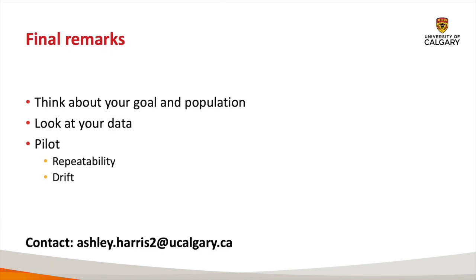So with that, I'll make a couple final remarks and recommendations. When designing your GABA study, always think about really what your goal is and what your population is and what makes the most sense. Always look at your data. It's always useful to know what your data actually looks like and what your quality is. Are you able to resolve that GABA peak? What artifacts are there? What contamination is there? And then I can't recommend enough piloting prior to starting an experiment. You can look at your repeatability, you can look at your drift, and all of these things are going to impact the quality of the data across your experiment. With that, I welcome any questions by email, and thank you for your attention.